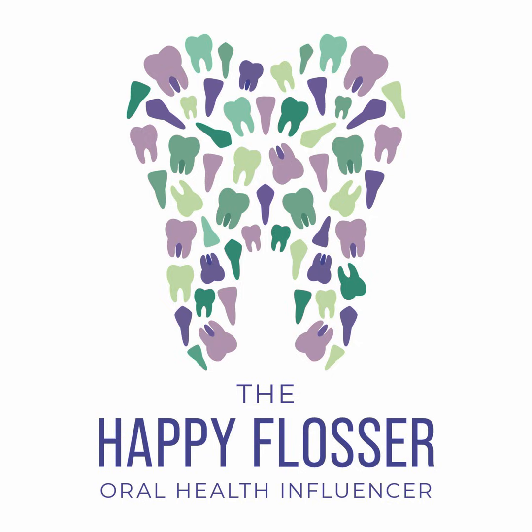And at the end of the day, when you take an image, regroup and think about it. Critique each image as you take it, and if you need to make adjustments or don't know exactly what adjustments you need to make in order to change course or achieve the goal that you're looking for, ask your faculty for help.